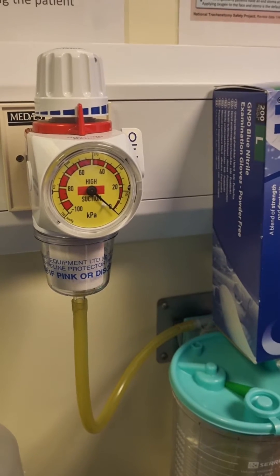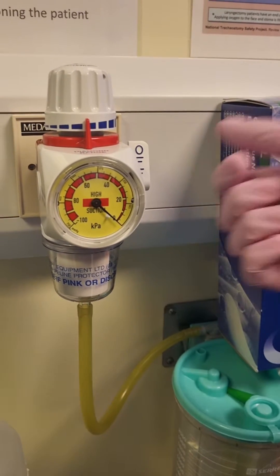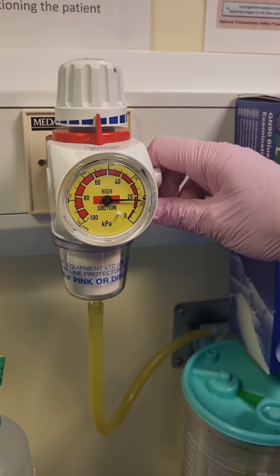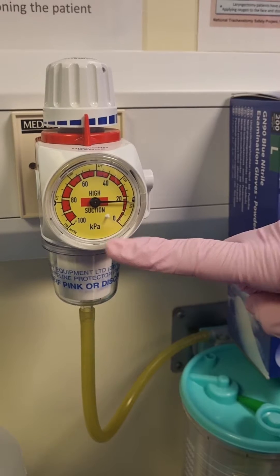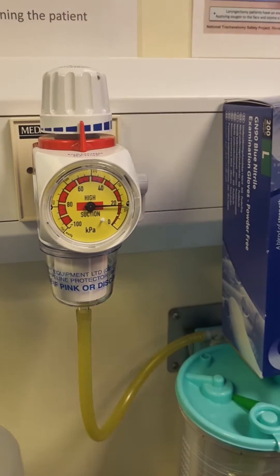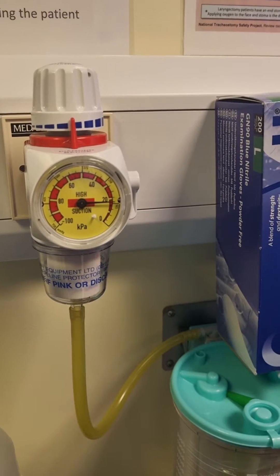To provide suction using an open system, ensure that your suction machine is set to a maximum of 20 kPa pressure. Anything greater will cause trauma to the patient.